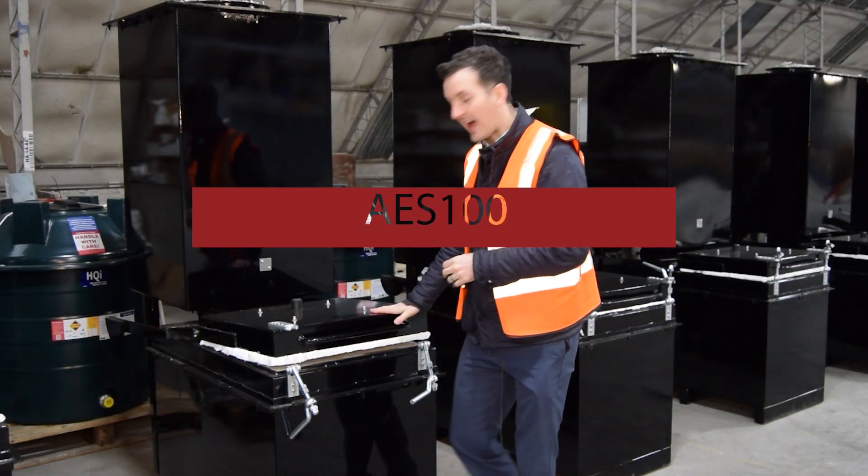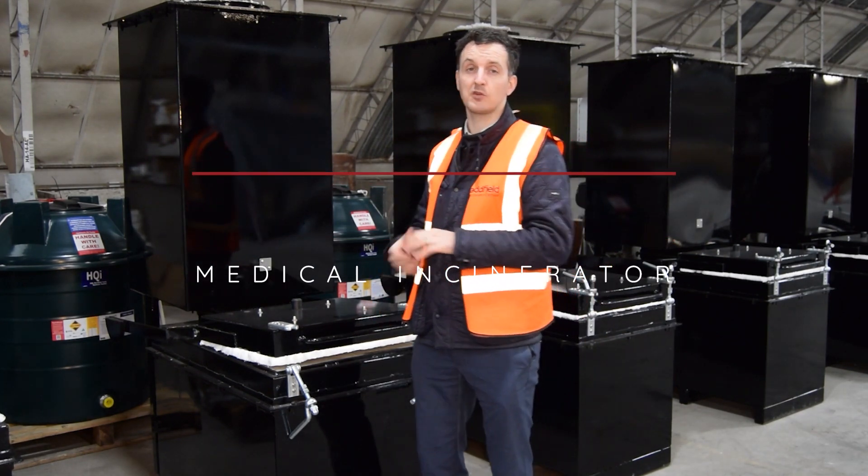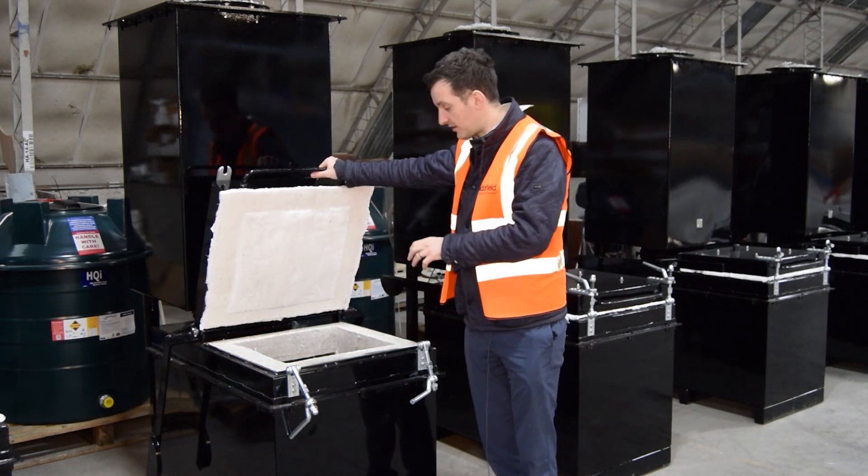Hi, today we're looking at the Adfield AES-100. It is predominantly a medical disposal machine, so we can load anatomical waste, clinical waste, and needle waste into this machine.